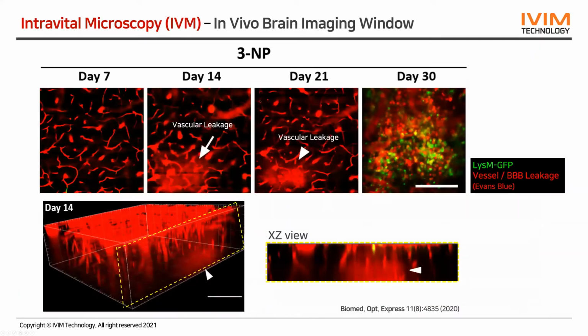And this is 30 days observation of the same animal in the brain cortex. You can see this specific blood vessel morphology here. So this is actually the same site. You can see, this side here and it's here.